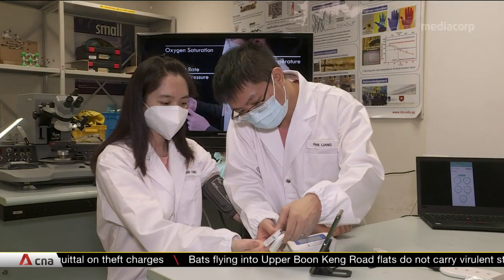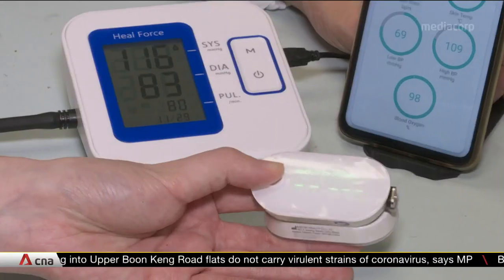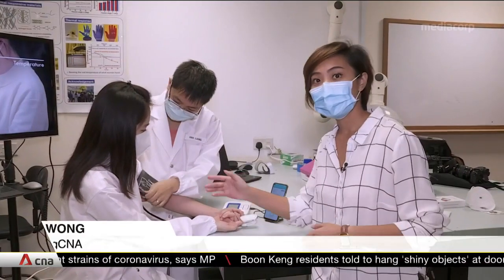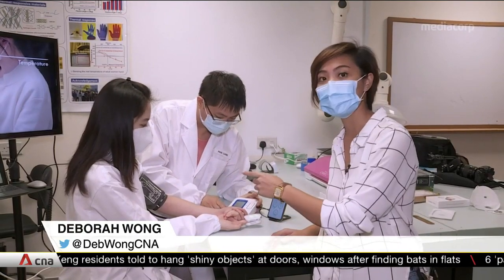The team from Nanyang Technological University and ASTAR thought of the idea in March. They are now running tests in areas like durability and accuracy. The sensors in the mask are measuring blood oxygen saturation level as well as blood pressure through the wearer's facial arteries.